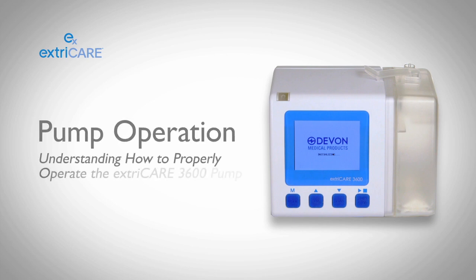Please follow along as we take you through the different steps on how to operate our extriCARE 3600 pump.